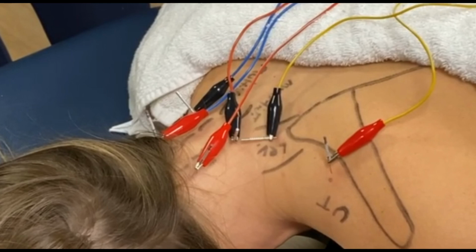To set up the leads for electrical stimulation, you'll do 1 channel on one side of her cervical paravertebrals. So in this picture, you see the blue wires as a black and a red on the right side of her neck. And then you'll set up the second channel on the left side of the cervical paravertebrals. So as you see, the red wire has a black and a red on the left side of her neck.